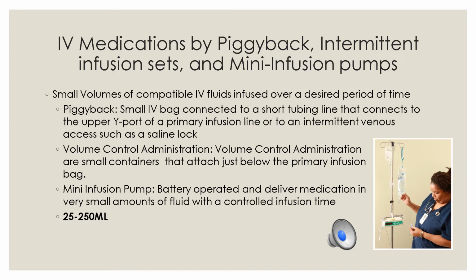These are small volumes of compatible IV fluids infused over a desired period of time. When you see these, I think of IV antibiotics giving like this. We also give IV Tylenol and IV morphine or IV ibuprofen as a piggyback. They usually go over anywhere from 15 minutes to 2 hours. A piggyback is a small IV bag connected to a short tubing line that connects to the upper Y port of a primary infusion line or to an intermittent venous access such as a saline lock. You'll see this on the next slide so you can visualize it.